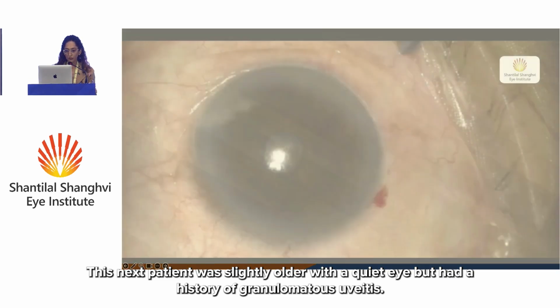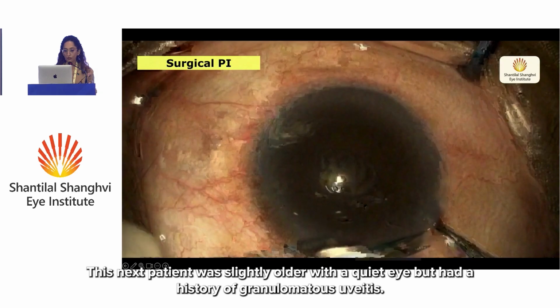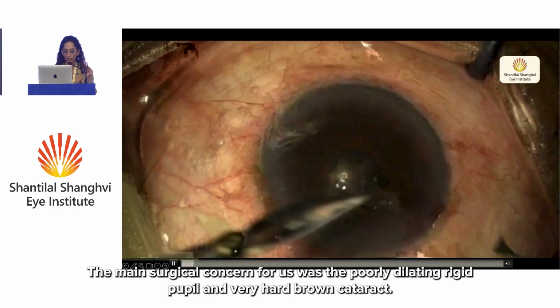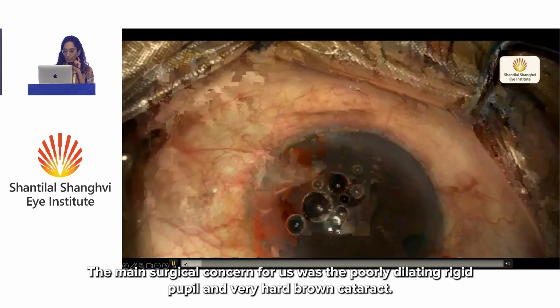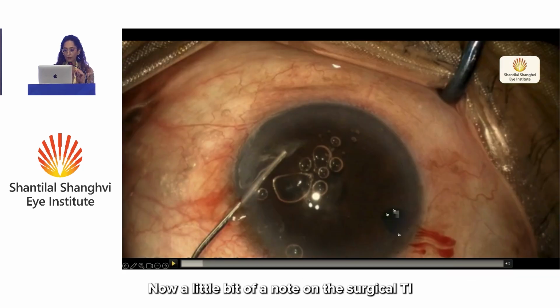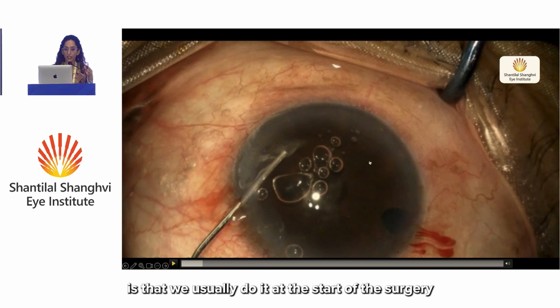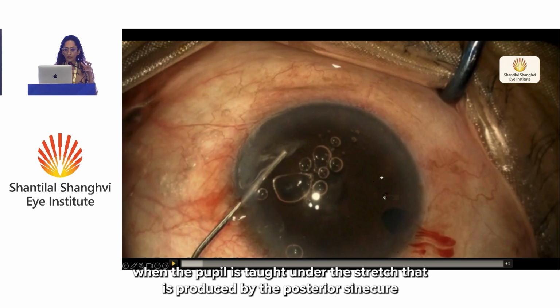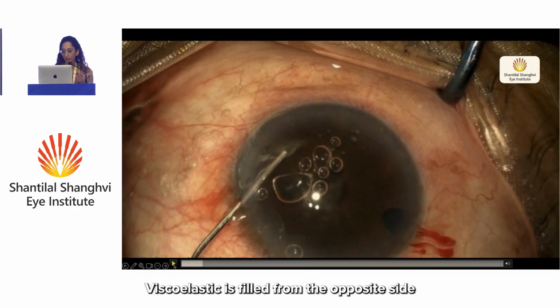This next patient was slightly older with a quiet eye but had a history of granulomatous uveitis. The main surgical concern for us was the poorly dilating rigid pupil and very hard brown cataract. Now a little bit of a note on the surgical PI which we make at the start of surgery. This is usually done, and this I've learned from Dr. Somshila, at the start of the surgery when the pupil is taut under the stretch that is produced by the posterior synechiae and the presence of a membrane, and therefore making this at the beginning is actually more beneficial than making it at the end.